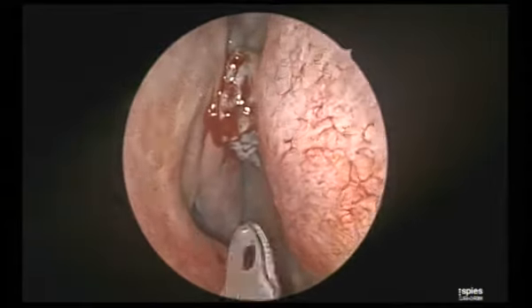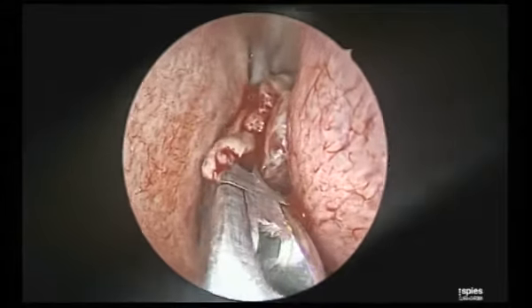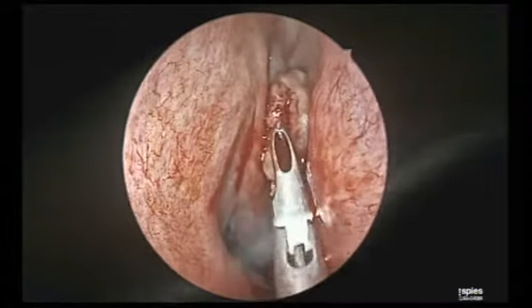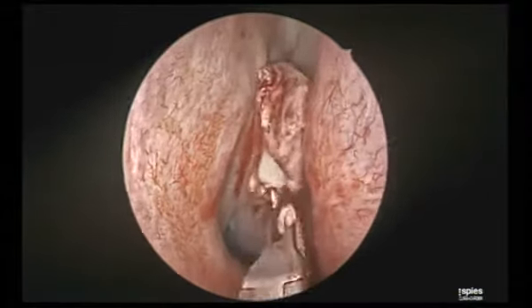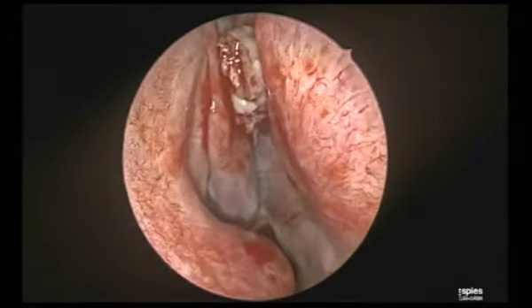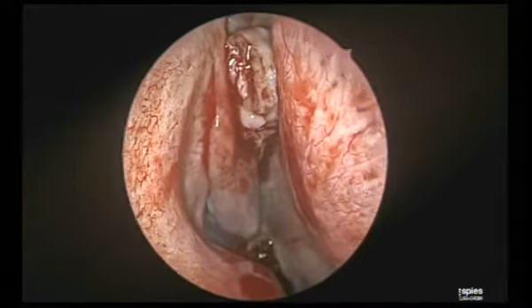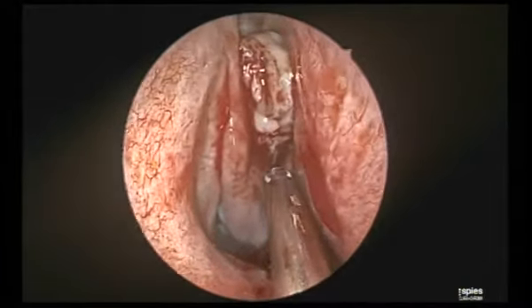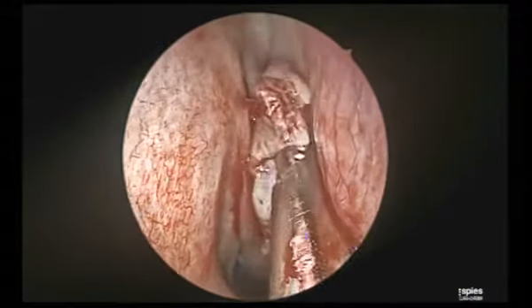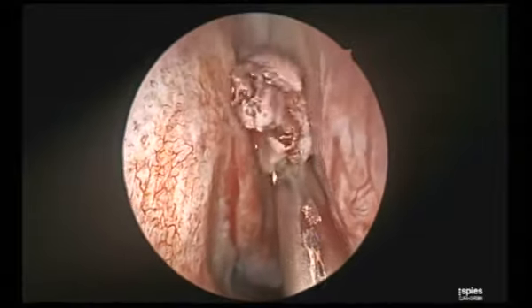Now in our protocol we have included taking mucosal histopathology. I take the biopsy from the most relevant sites in the polyp, and this dictates our post-operative treatment. Whenever we get the time to discuss, in every case we take biopsy from the surface to see so many things: whether there are biofilms, what is the thickness of the basement membrane, how is the mucosal eosinophilia, which is the most important marker, and that will dictate our post-operative treatment.